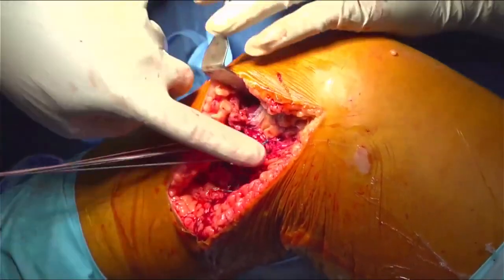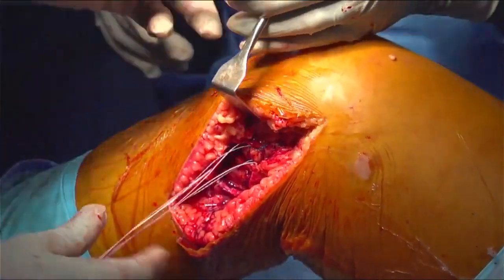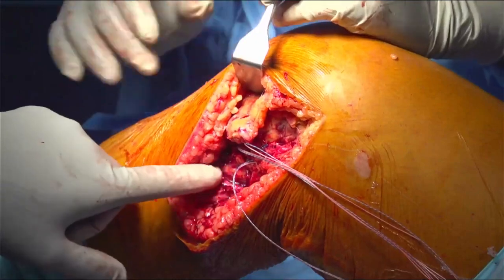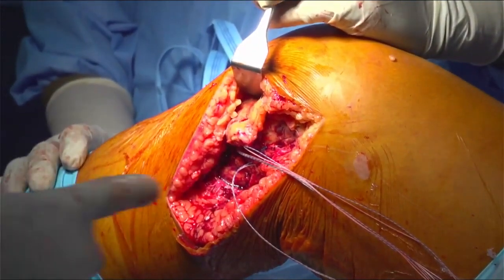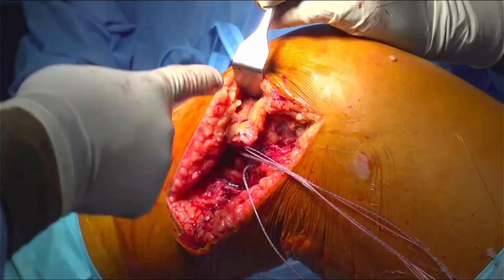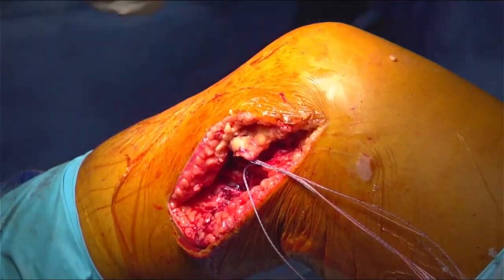Okay? You can see that this is very good. Everything is now into its place. This is the semitendinosus tendon. Now we are done with my MCL repair here. So we have done what is called a double row repair of the MCL. So if there is a superficial ligament avulsion, then we need to use an all suture anchor, something which provides a cortical fixation. Here it was a meniscotibial ligament rupture. So we did a procedure for the cancellous bone by using 5.5 mm anchors. Okay? Thank you. Now we'll focus our attention on the arthroscopy.